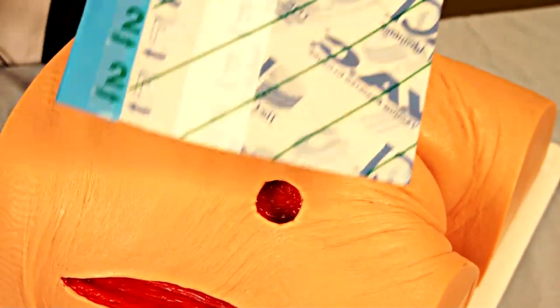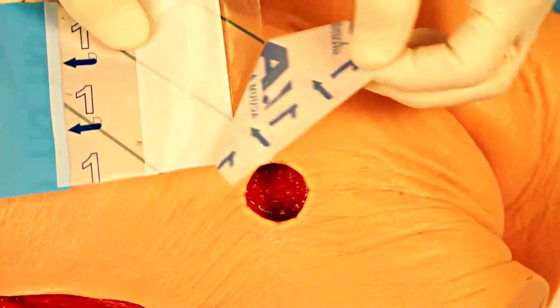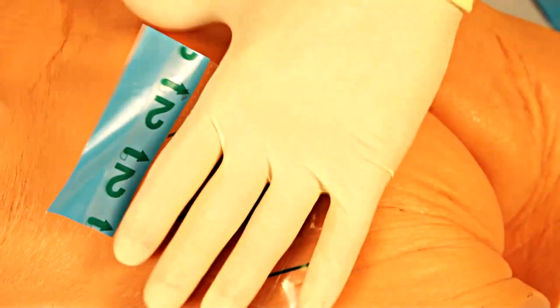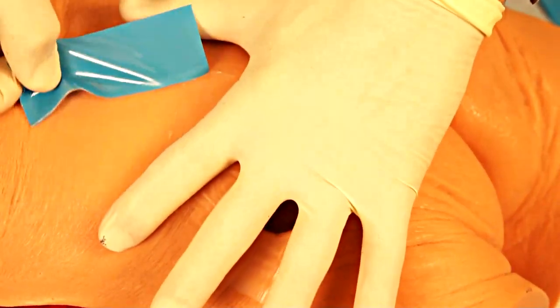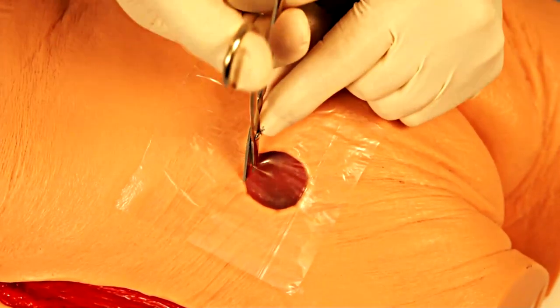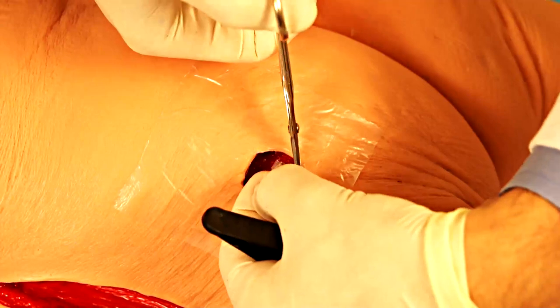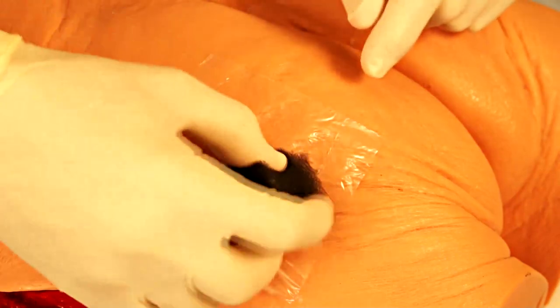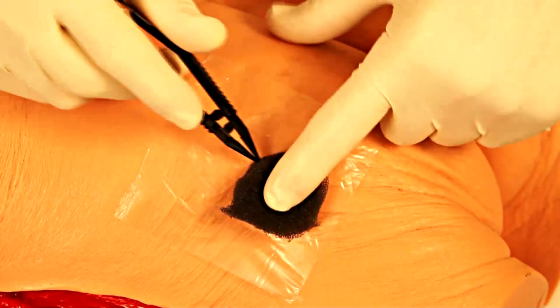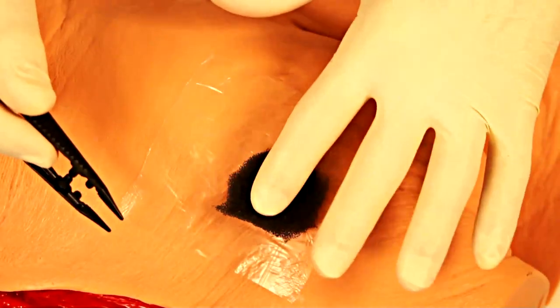This would be achieved by cutting a portion of your adhesive dressing, removing layer number one, occluding the wound, removing layer number two, and tearing off the leading edge. We would then cut out the dressing around the area, keeping the normal skin covered with the adhesive dressing. We would then insert the sponge. Now you can see that even though the sponge covers the edge of the wound onto normal skin, the initial layer of the adhesive dressing provides a barrier.